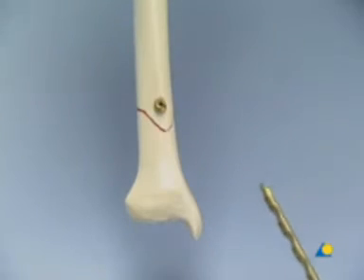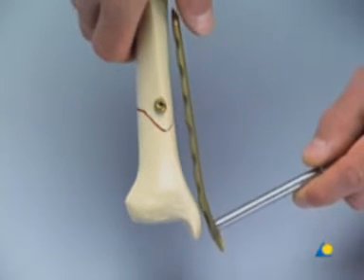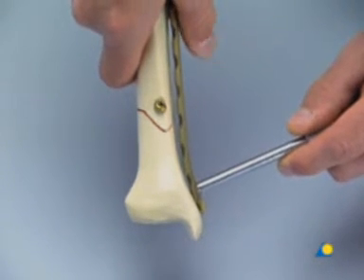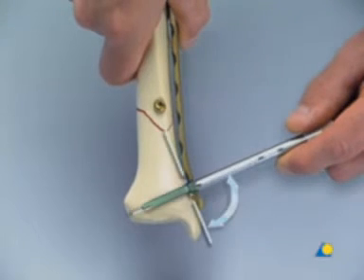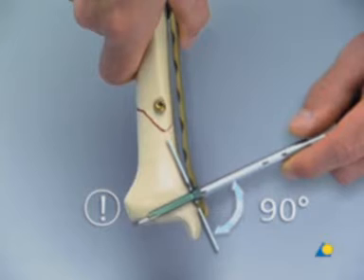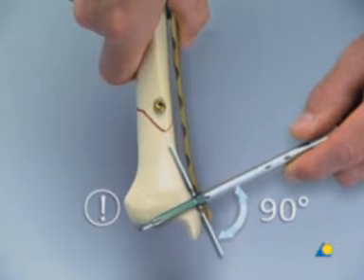The LCP has been slightly bent at the distal end. The plate, with the LCP drill sleeve screwed into the most distal hole as a handle, is gently inserted and slid along the medial aspect of the tibia. As the locking head screws cannot be angled, care must be taken when positioning the plate to prevent screw penetration of the joint.